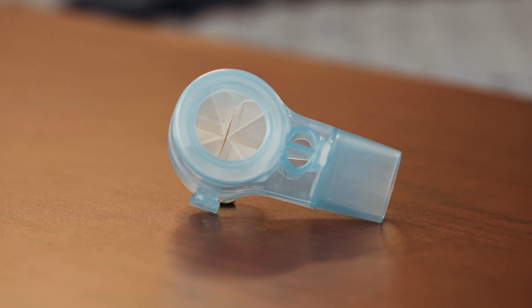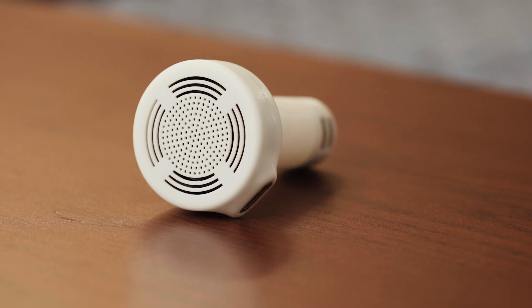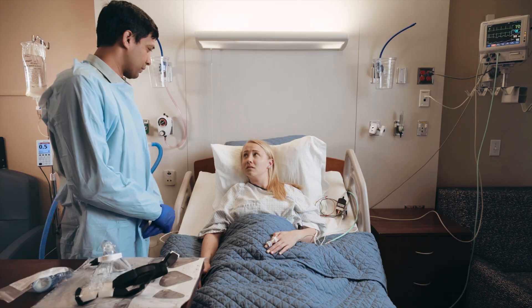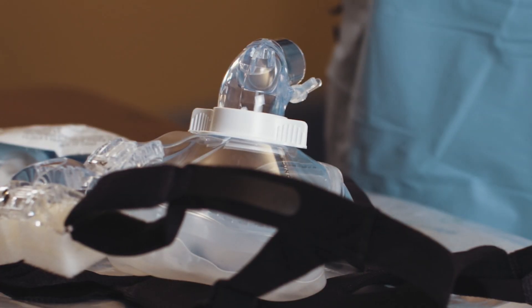To use a ReadyPort single-use product, first select the appropriate mask size for the patient. The ReadyPort elbow is compatible with several masks. Before you place the mask on a patient, remove the standard elbow.